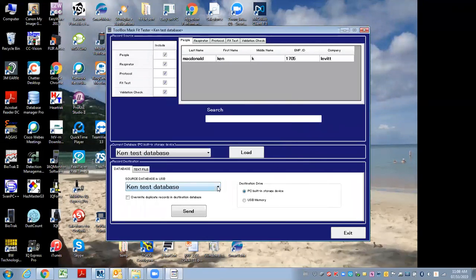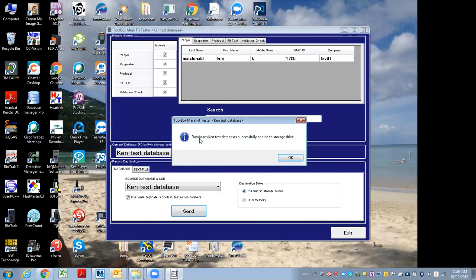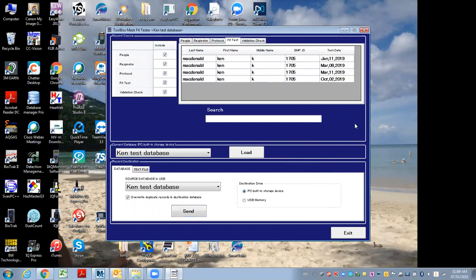Now it's going to ask where it wants to put it in the computer itself. I hit overwrite again and then hit send. It says the database was successfully copied to this storage device, which is basically your computer. So any new fit tests, people, or anything that you've added in the field with the AccuFit 9000 is now in the computer, so you're able to run fit test reports from the new fit tests done.